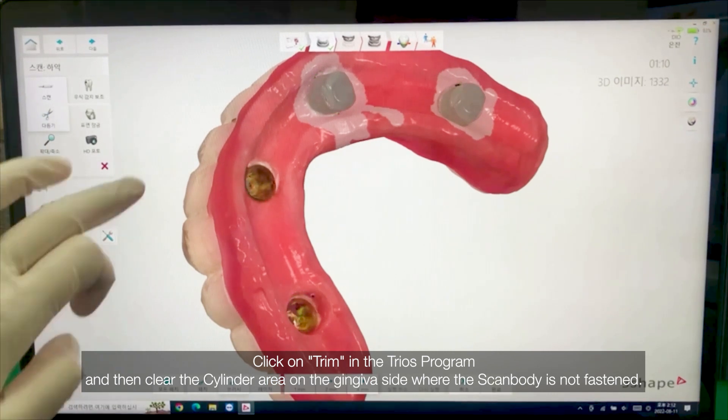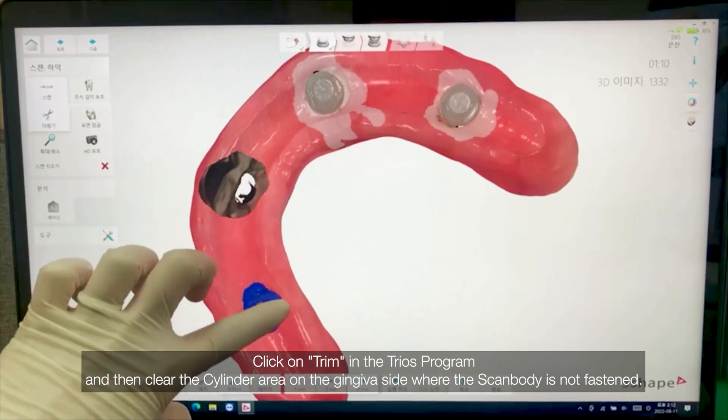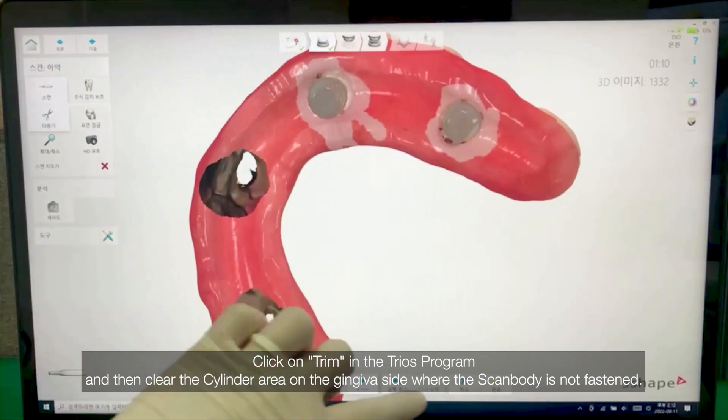Click on Trim in the TRIOS program and then clear the cylinder area on the gingiva side where the scan body is not fastened.